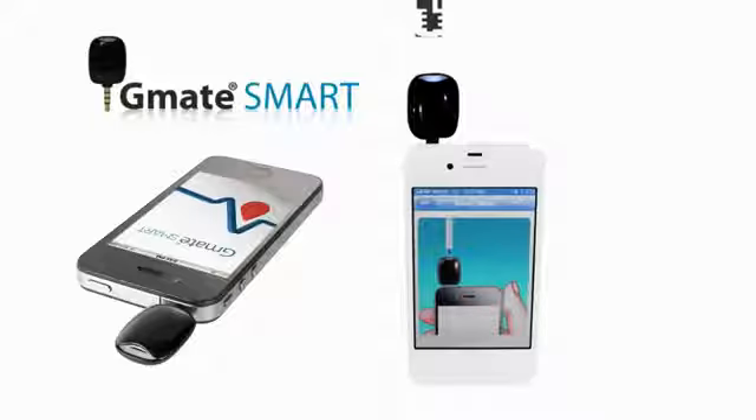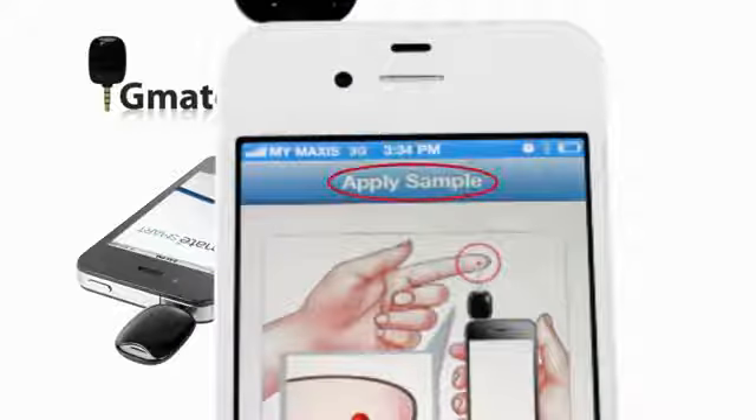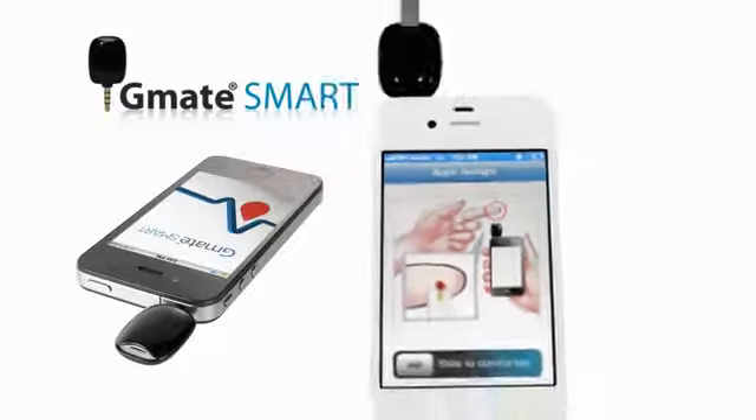Insert the test strip using gentle pressure. Do not force the strip into the meter. Apply Sample will appear to let you know the meter is ready to be tested.